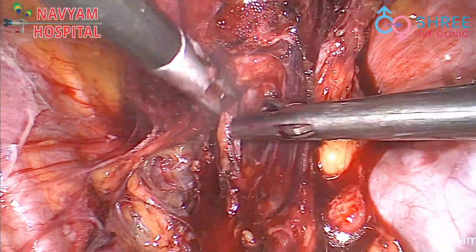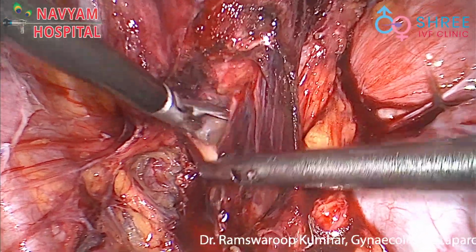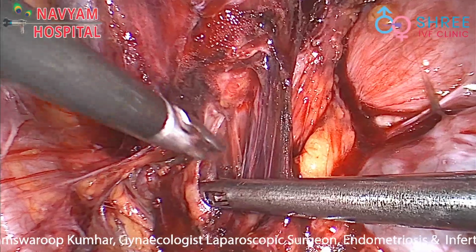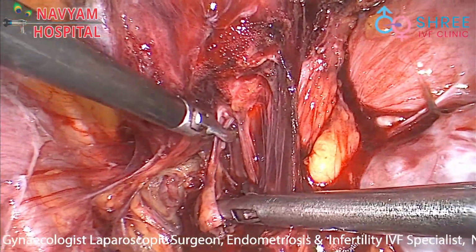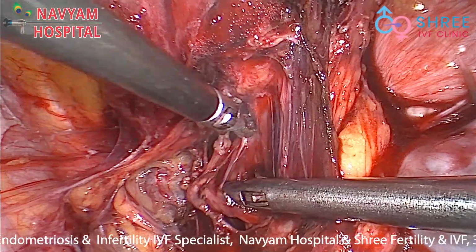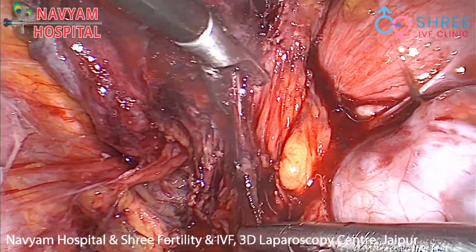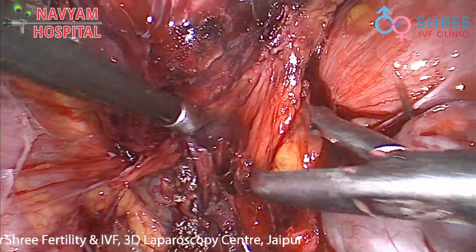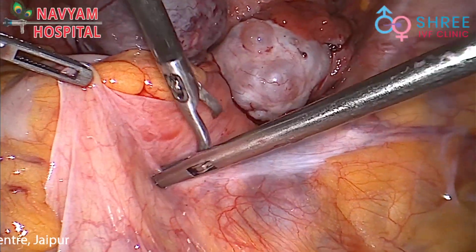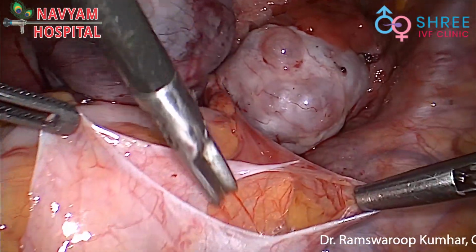The ureter was dissected away from this mass by means of blunt as well as sharp dissection, and we have to make the ureter free from these adhesions. These few remaining fibers were cut down. After completing the dissection on the left side, we approached the right side with the same retroperitoneal approach.